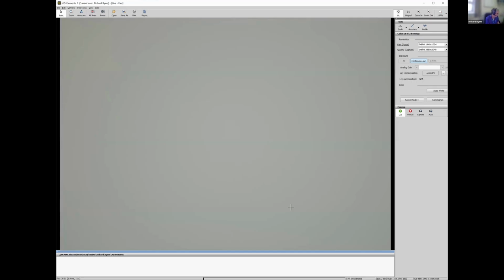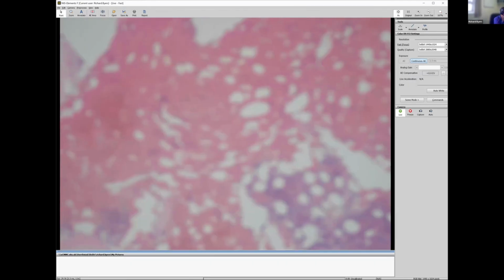So I'll take another case from one of my biopsies that I did. So this one is a woman born in 1981. So she's 43 at the moment. And she's got a history of cutaneous mastocytosis. So this is a very interesting biopsy. And it forced us to look into the criteria for systemic mastocytosis, which I'll just bring up and we can discuss those. It's a good learning point.